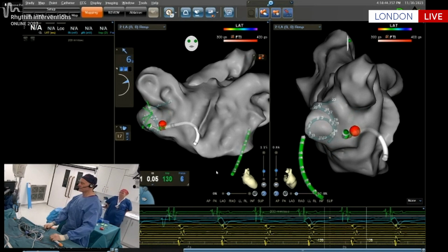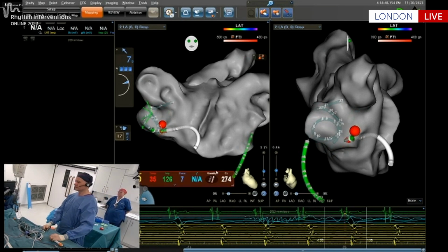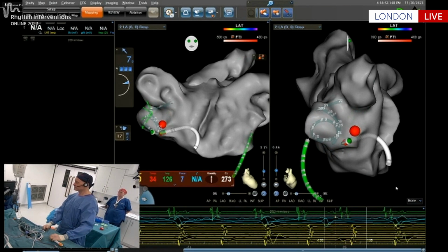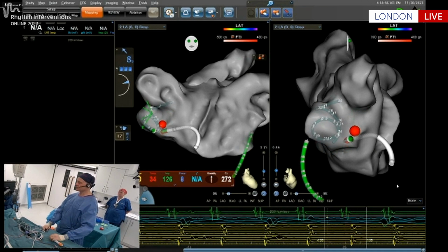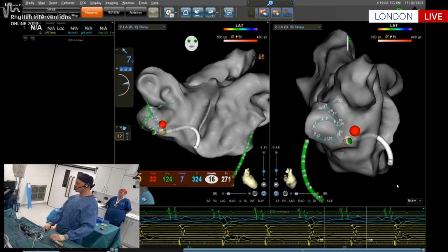And so far, I've never had a tamponade or an esophageal fistula. So for me, that's a reasonable strategy. So I'm going to do 2 speculative burns here, and then I'm going to leave this vein because I'm not sure how important it is, because I want to get to the action and we'll deal with the vein afterwards.